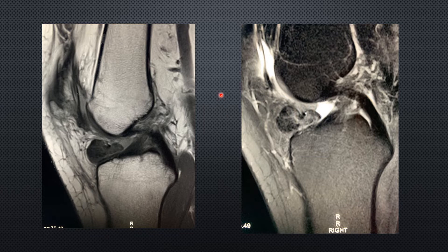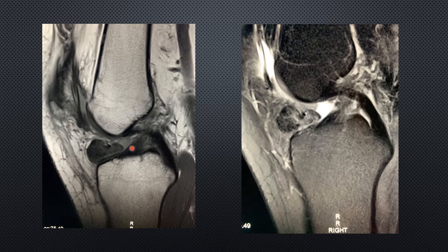The first case shows sagittal T1 and T2 with fat suppression images of the knee joint. We see a well-defined mass at the infrapatellar fat pad, also known as the Hoffa's fat pad. It shows regions of intermediate and low T1 signal intensity as well as low T2 signal intensity. Inside the lesion we see some regions of intermediate to high T2 signal intensity. There is no significant surrounding edema. This lesion is anterior to the tibial attachment of the ACL, and it is probably causing impingement and mechanical problems.